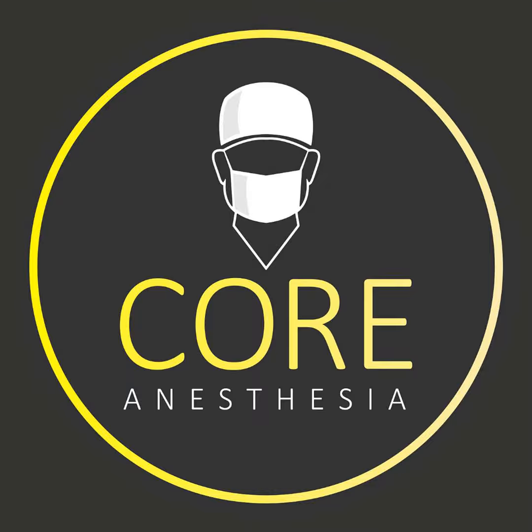And that's, again, starting from your preoperative assessment, why that's so important. Another monitor that we would want to consider, depending on the stability of the patient, looking at their lab values, looking at the potential blood loss with a procedure, and looking at the strictness that we need to be managing blood pressure. If we're doing a carotid endarterectomy, where we need to be managing their blood pressure specifically beat to beat, then obviously an A-line would be a consideration there to have a closer grip on their blood pressure.